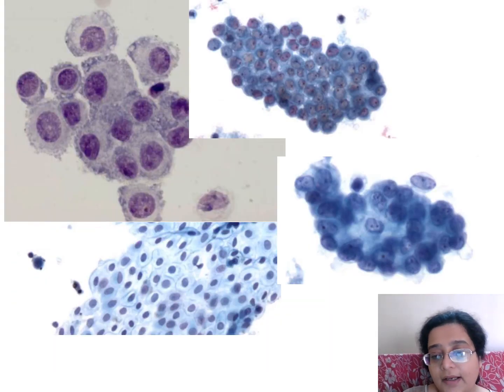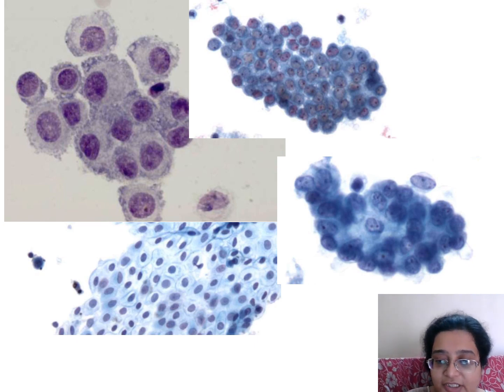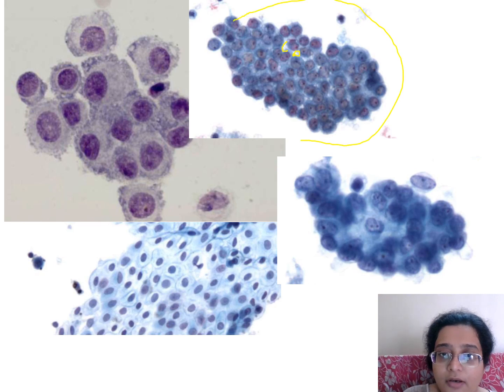Now these cells, when they come out in the fluid, they come as sheets and clusters. So here you can see a honeycomb kind of a sheet. If you see there are spaces in between, you see this, but this is a tight cell ball. Fine, and you can see prominent nucleoli also. But this is benign because these are very uniform. See, the nuclear chromatin is so uniform. The sheets are honeycomb-like with space in between. Fine, this kind of a knobby kind of thing is there.